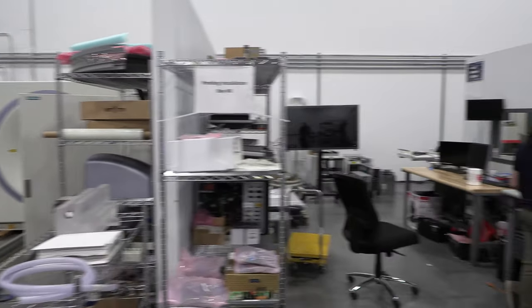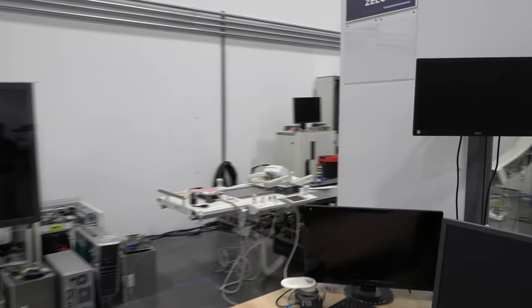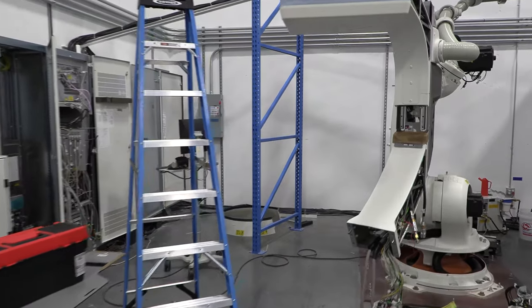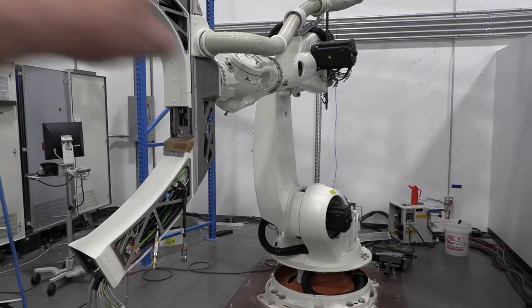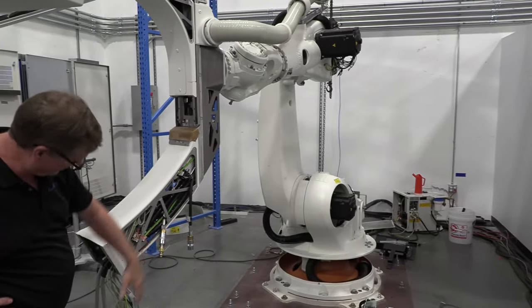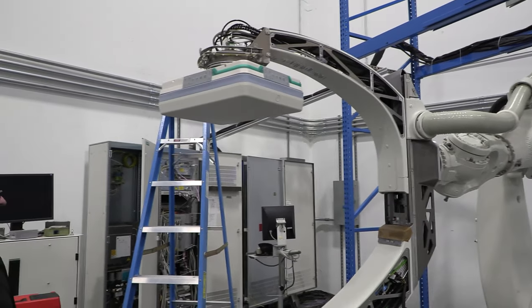Here we go. This is where we get into our Siemens cath labs. Oh man, I already see something that I'm interested in. Look what is hiding back here. It might not look like much, but guys, this is a robot that's the size of a Volkswagen. I saw the coil up in the ceiling and immediately knew what it was. When we got this in, we noticed there was some cracking in the metal, so this is all going to get pulled out and replaced. Look at the scale.